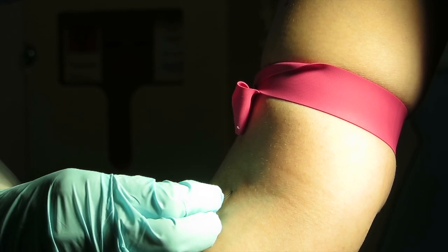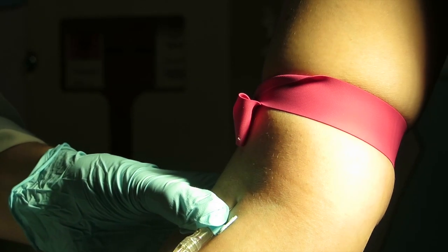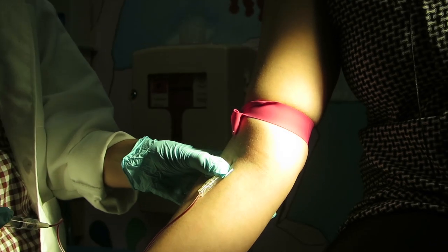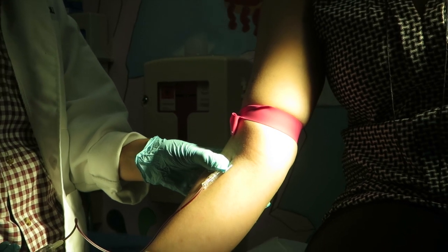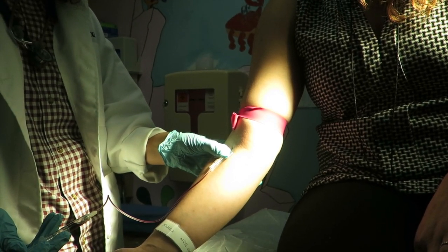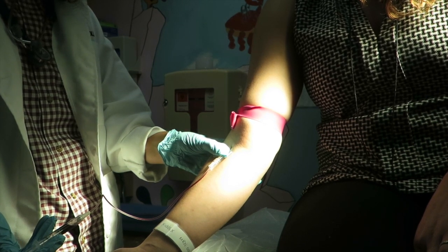Perform venipuncture and collect a blood sample with one of the following methods: butterfly needle with attached syringe; IV catheter with T-connector using either a sterile syringe or sterile vacutainer; or sterile syringe with sterile transfer needle collecting drops from the IV hub. Do not collect a blood culture by drawing back on an already placed IV.